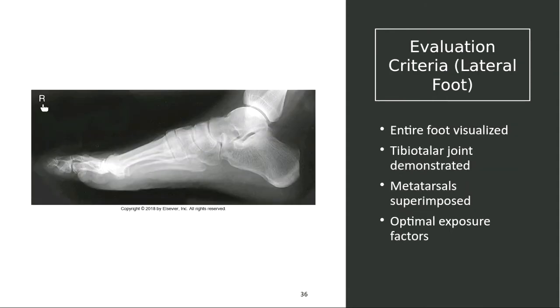either way, because now when it's a lateral foot, it's going to hang with the toes pointing either to the left or to the right, depending on which lateral it is. You again have to demonstrate the entire foot. You should visualize the tibiotalar joint right here.